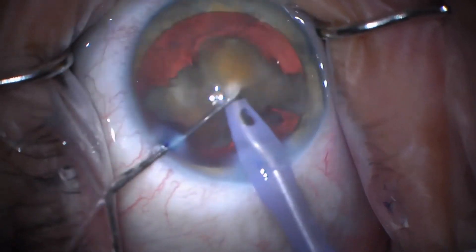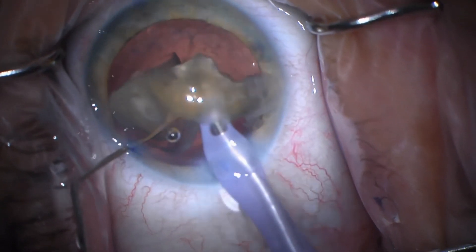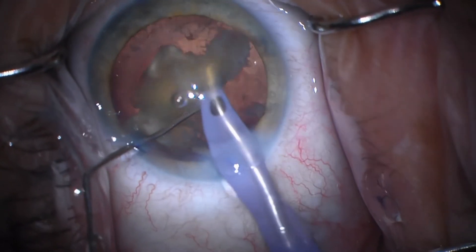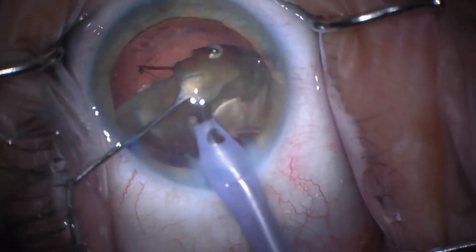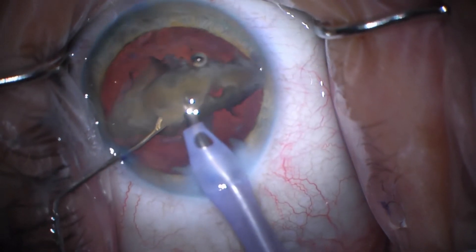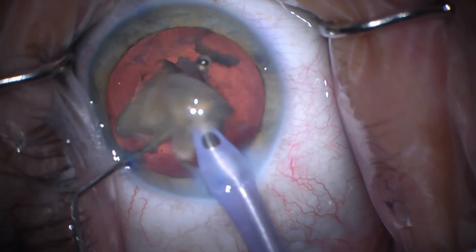This is just to show you the contrast between having a lot of small pieces versus bigger pieces — how much better the fluidics are and how much easier it is, especially when you have this positive infusion pressure with OSEL. So in this case it's not a big deal, but it just took a little longer. This took probably four or five times as long as those other small pieces to remove. If I just would have chopped it into two pieces, it would have been much easier.